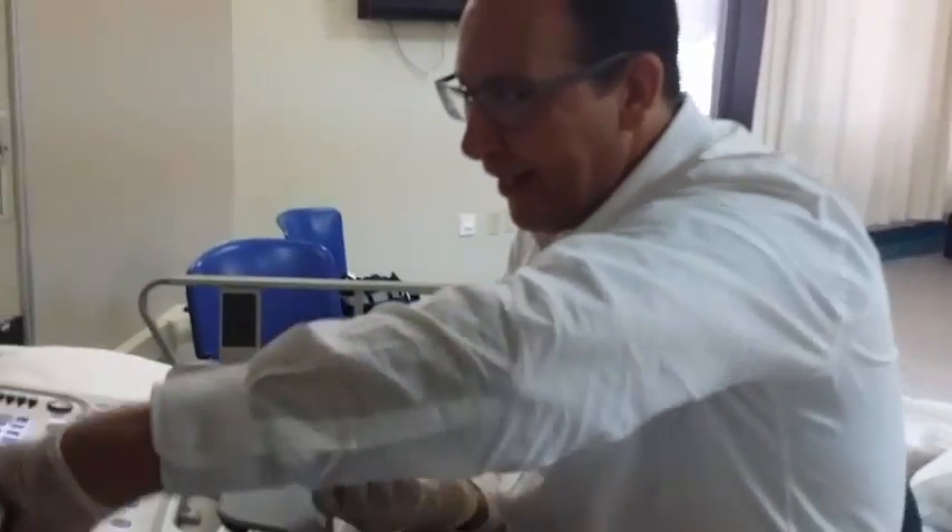Today we will demonstrate a very important topic which is Transcranial Doppler. We will do a live study of the right side of the middle cerebral artery, which is the most important intracranial artery because it accommodates almost 80% of cerebral circulation.